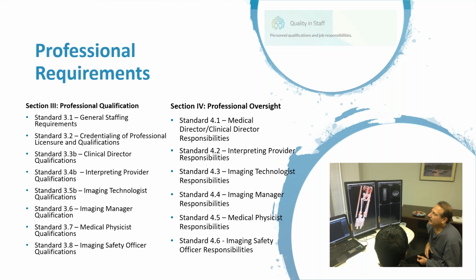3.3B is the qualifications for the clinical director. It has a partner for medical, but we want to focus with ConeBeam CT on a standard that's really broad enough to support a potentially non-physician clinical director. And so with 3.3B, we do that.